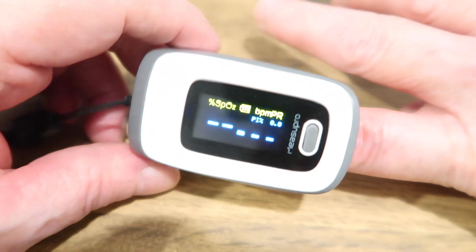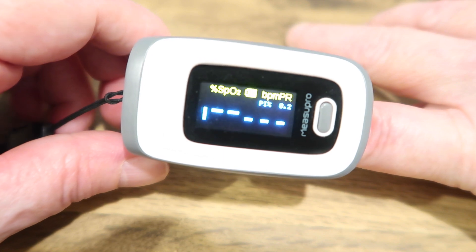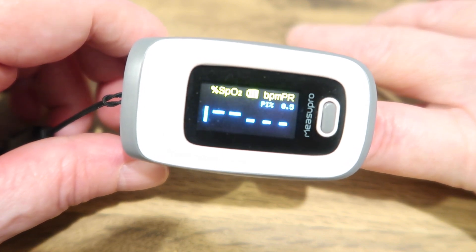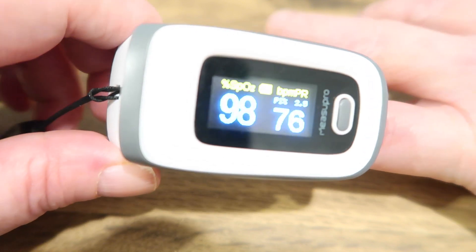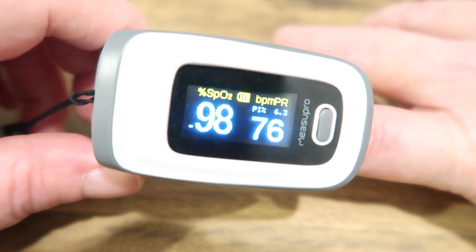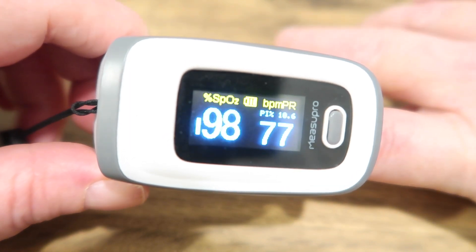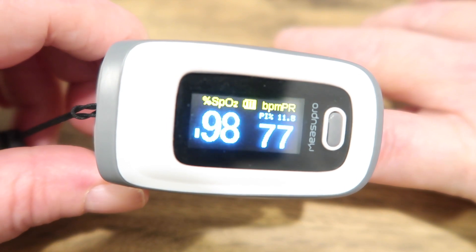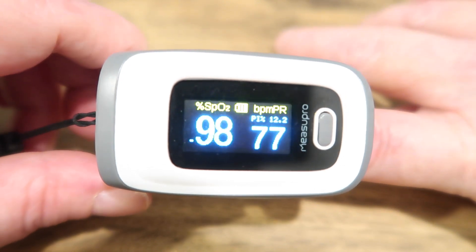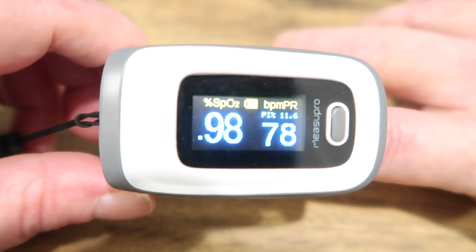To use it is very simple: you just switch it on and then put your finger in with the fingernail pointing upwards, and it'll tell you what your oxygen levels are in your blood. Mine is 98 and it's telling me my pulse is 76. Doctors have criteria for who they think needs treatment in hospitals, and it's usually when the oxygen levels get below 94.